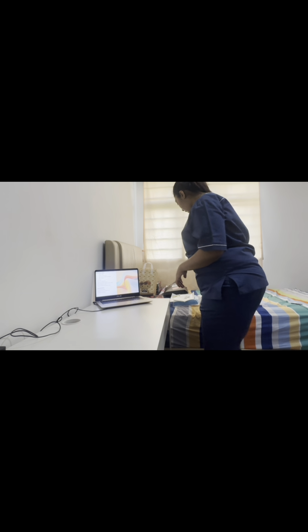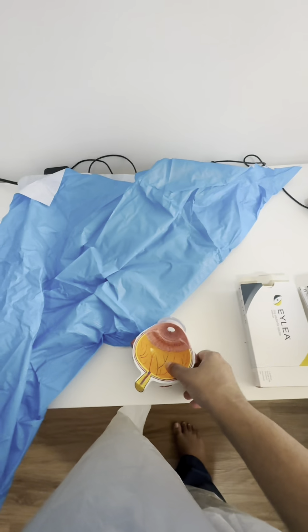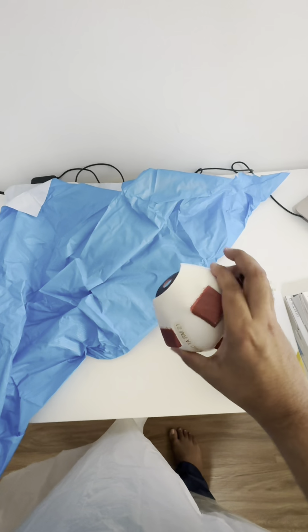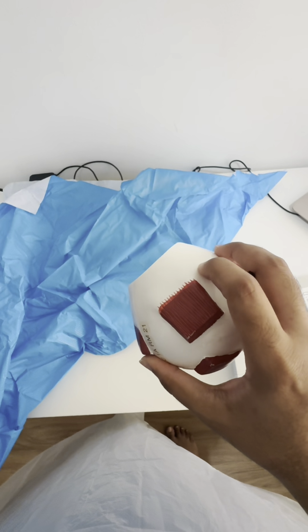Okay, now let's begin with the hands-on part. Hand rub is readily available at all working stations. You prepare the set, this is how it's supposed to look. Now for the patient's eye, look at the anatomy. It's just a dummy. So this is the eye, and the doctor will inject over here, which is the sclera, the area here.